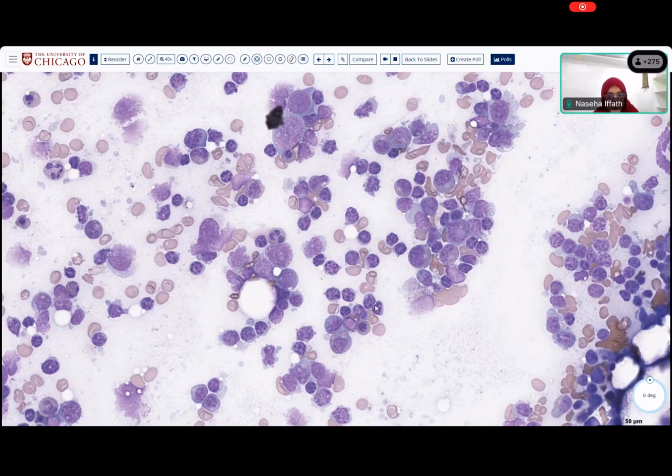Lymphoid lineage. Okay, so this is maybe an entity that one doesn't encounter very often in India, but it is the commonest malignancy that we encounter in the Western Hemisphere, particularly in the United States. So these are lymphoid cells. Unlike normal mature lymphocytes, they have chromatin that's really, really clumpy. So for example, if you compare it to this cell here, the chromatin here is very clumpy, and it's referred to as chocolate chip cookie or cracked earth. So if you go into Rajasthan and it's very, very dry, you look at the earth, that's the appearance of the earth. So cracked earth, chocolate chip cookie, soccer ball, golf ball, whatever you want to describe it as.